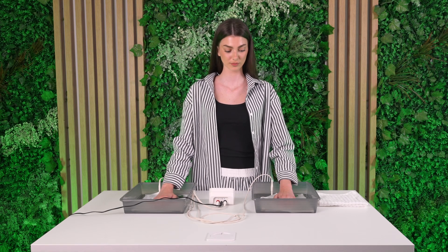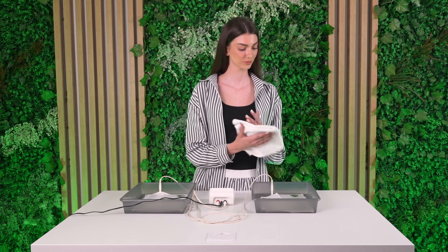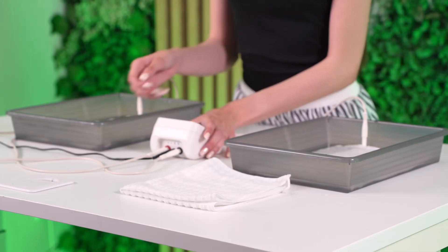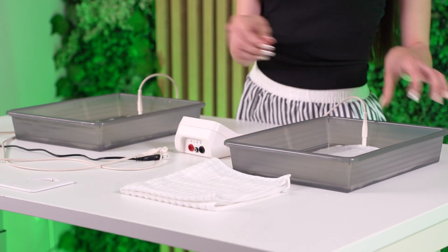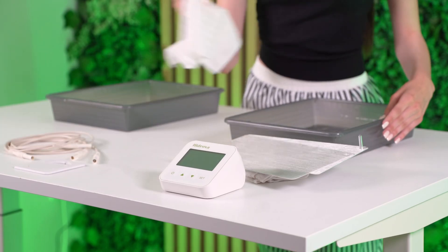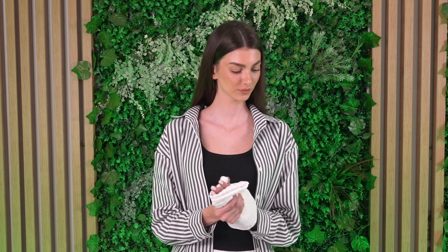Sit still during treatment. When time's up, the device will beep and stop. Gently lift your hands out and pat dry. After each session, unplug the device and disconnect the cables. Remove and rinse all parts used. Dry thoroughly with a towel and let them air dry. Apply a moisturizer to the treatment area if it feels dry.